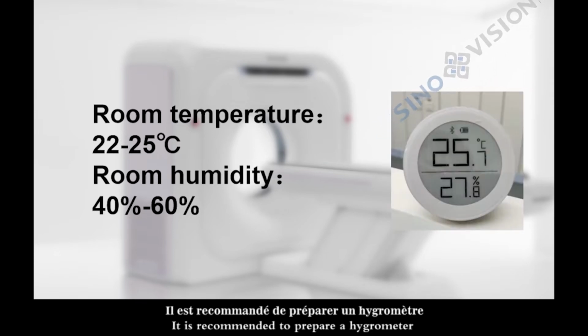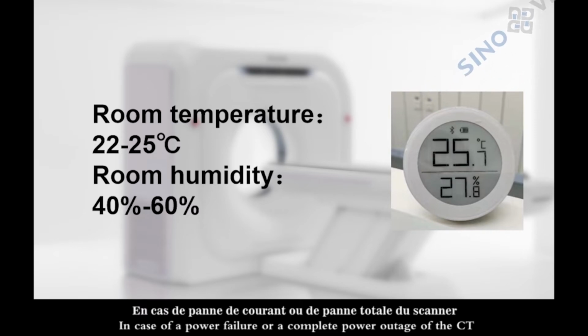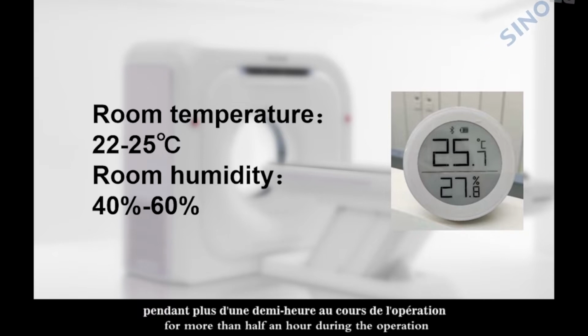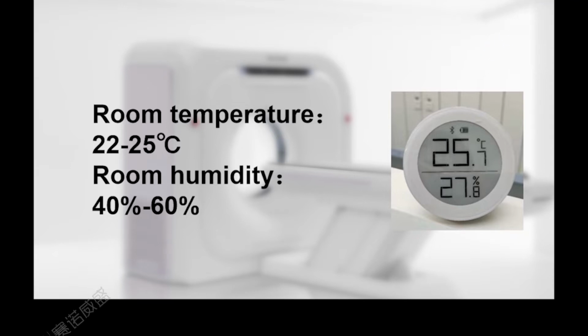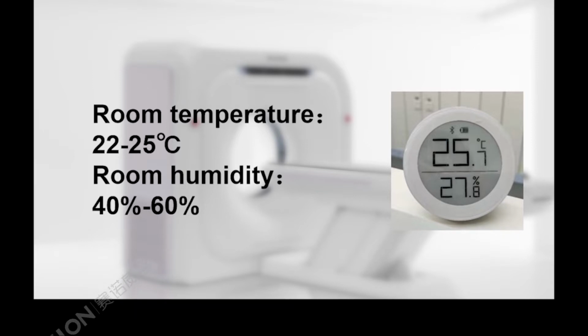It is recommended to prepare a hygrometer to monitor the scan room conditions at any time. In case of a power failure or a complete power outage of the CT for more than half an hour during the operation, wait for 2 hours before doing any patient scanning.